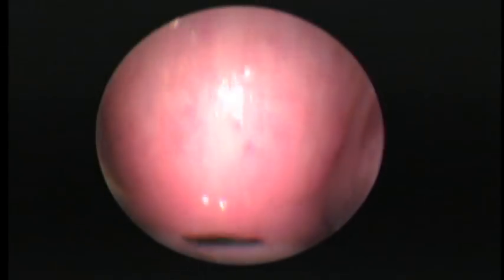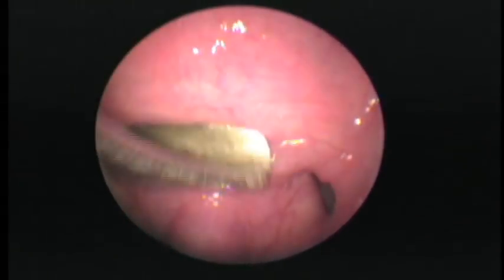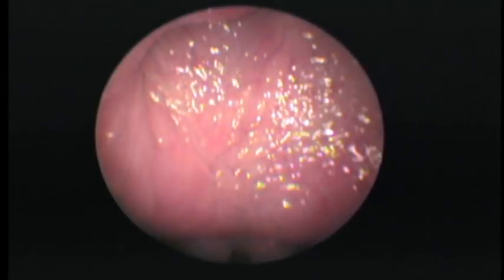I want to make sure that the soft palate is about a centimeter around that distance. If you stretch it out, maybe it would cover the epiglottis by about a centimeter. And in these dogs, that's a pretty normal distance.